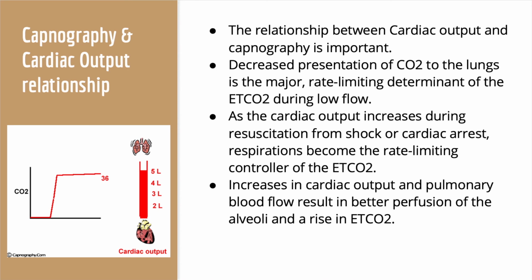Cardiac arrest is the ultimate shock state, meaning that there is no circulation or metabolism and no CO2 production unless effective chest compressions are performed. An end-tidal greater than 30 is associated with a cardiac output of more than 4 liters per minute. So basically, as the cardiac output increases during resuscitation from shock or cardiac arrest, respirations become the rate-limiting controller of the end-tidal CO2. Increases in cardiac output and pulmonary blood flow result in better perfusion of the alveoli, and that is what helps raise end-tidal CO2.